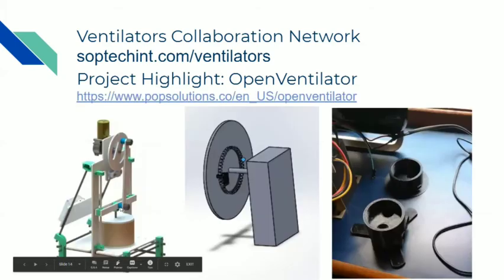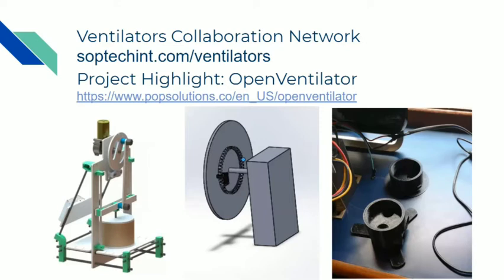I put it back. On the right part, you can see a 3D printed part that can also be injection molded for large production. Inside the pipe, we put an ultrasonic sensor to measure the water level. So with a cheap ultrasonic sensor, we can measure the pressure inside the patient, and it is a very common and easily found device.